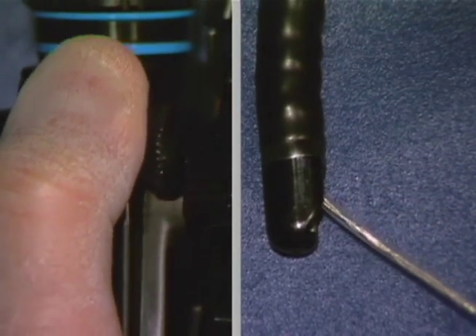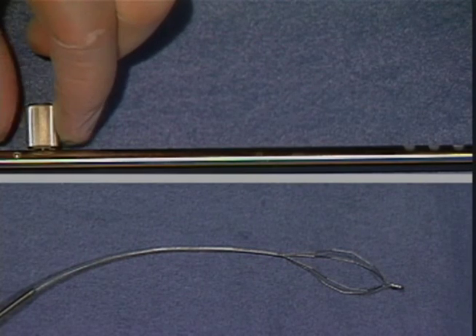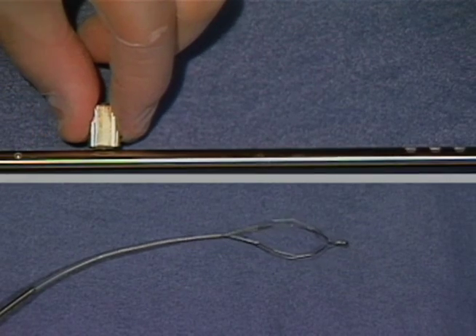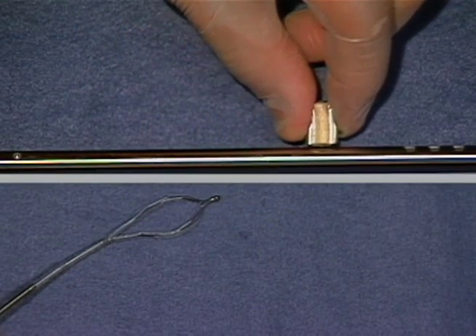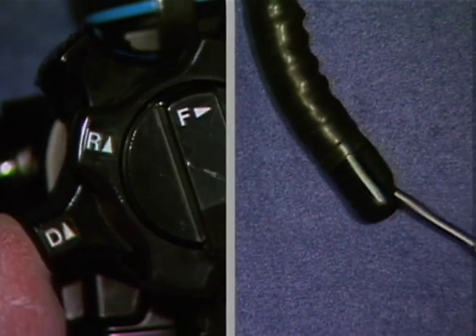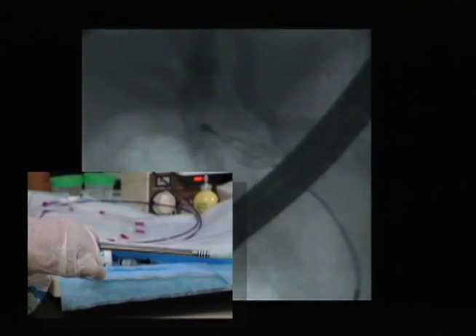Lower the forceps elevator. Loosen the knob of the slide region of the coil sheath. As you are slowly inserting the coil sheath, gradually slide the knob of the slide region by pulling the Teflon sheath into the coil sheath. If the slide movement of the coil sheath encounters resistance, do not force it. Relax the endoscope's angulation mechanism until the device can be passed smoothly. To perform this operation, cooperation between the endoscopist and an assistant is necessary.